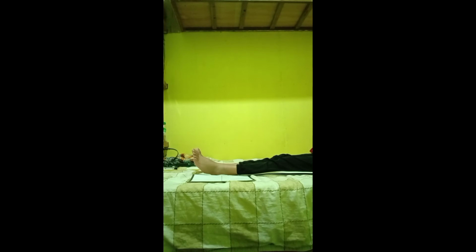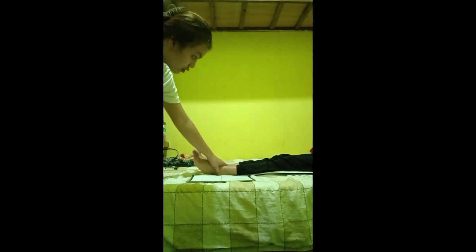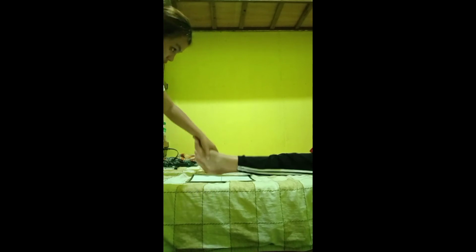The next projection that I will show you is the different projection of the ankle. First is the AP projection. The patient must be in a supine or seated position with the affected limb fully extended. So, yung patient ko po is naka-supine position siya. Nakahiga siya in supine position. So, i-extend ko yung limb ng patient.